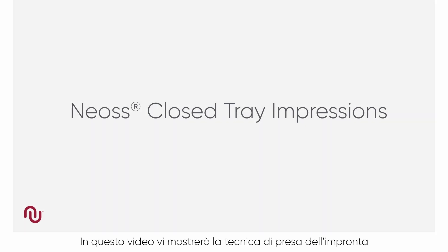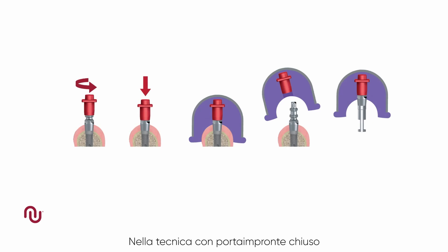In this video we will demonstrate the use of the NEOS closed tray impression technique. In the closed tray technique, the impression coping remains in the patient's mouth when the impression is removed.